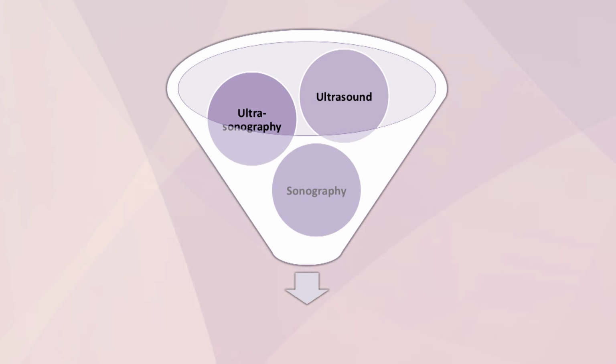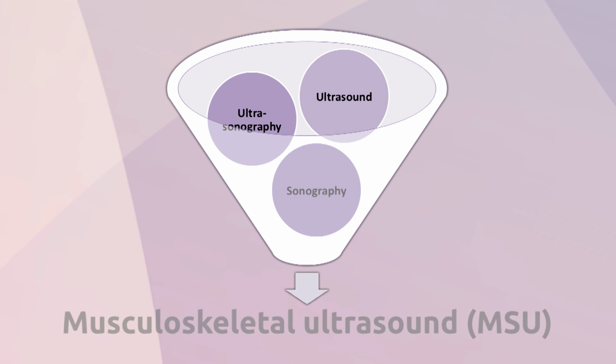The words ultrasound, ultrasonography, and sonography are all synonyms. This webinar is about ultrasound within the musculoskeletal domain. Musculoskeletal ultrasound, in short MSU.